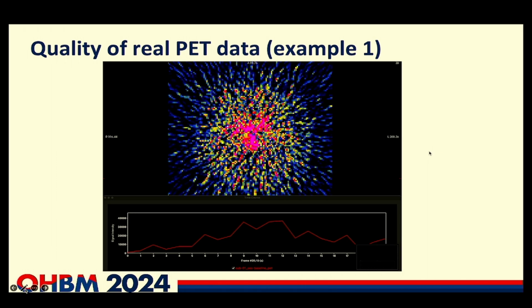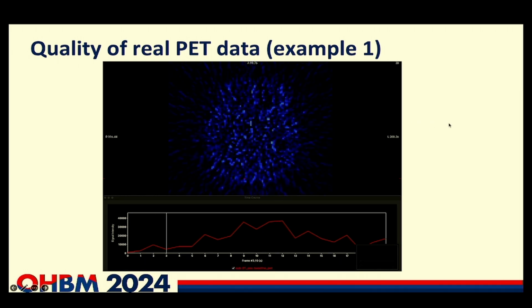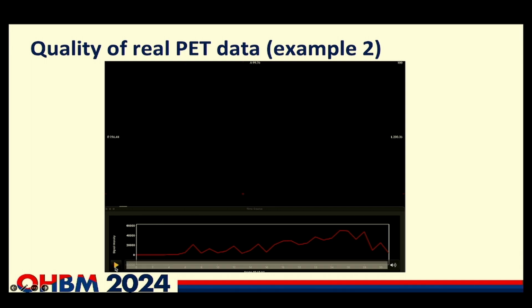All right. What you should also notice, and I'll get back to that, is that some PET images have these so-called striping patterns. You see that there's a lot of signal out here. That's because it's been reconstructed with filtered back projection. And let me just show you how it could look in newer scanners, where you've used a different type of reconstruction. And again, having this notion of how much we can compare data, these things matter, so please be aware of them when you go out and process your own data.